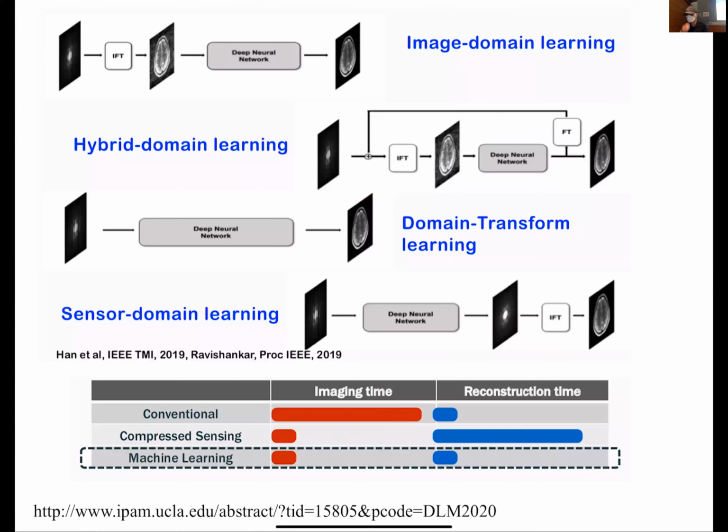Okay, so this is still an evolving area. People are still working on it, but there are different approaches. So for example, you can imagine taking your K-space data and doing inverse Fourier transform on it, get a very aliased-looking image, pass it through a network and clean up the artifacts. So that might be one approach. Or you could take something where you go directly from the K-space data through your deep network and end up with your image. That's like the AUTOMAP approach.